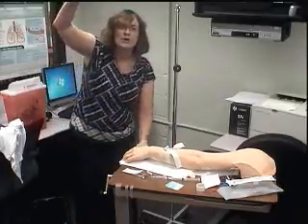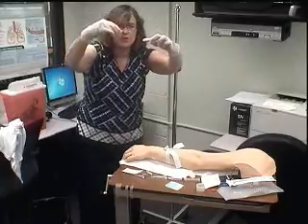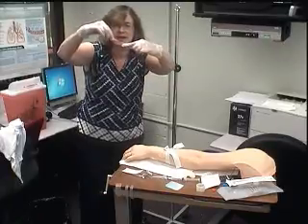You don't want to go so much that you go through. Here's my vein, if you go like this, you're going to go right through the vein. But you don't want to be just parallel, because you're just going to skim the vein. You want to actually get it in there. So here's my vein, I'm going in there, like boom.